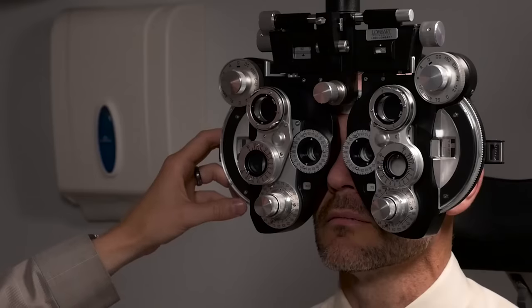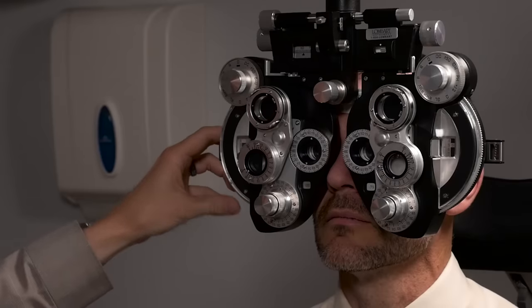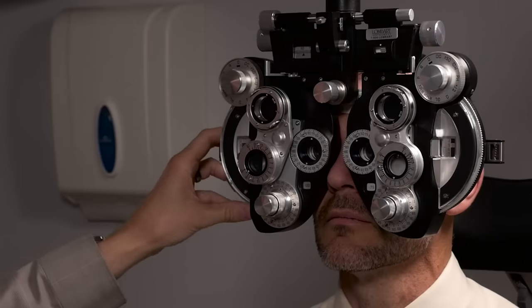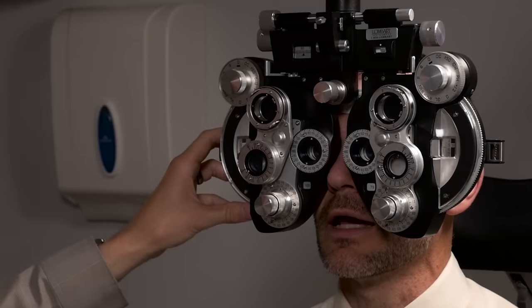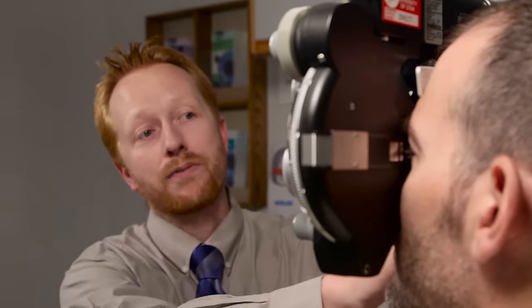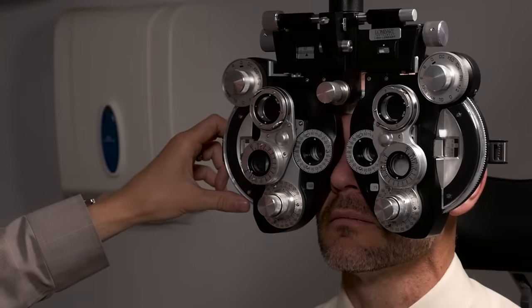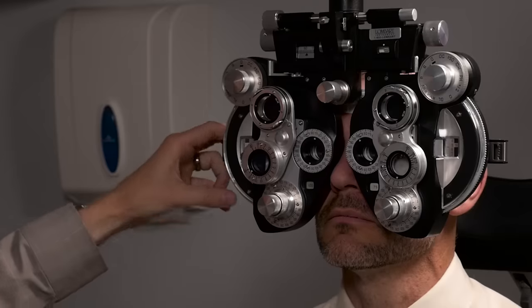So in this case I want you to tell me as soon as you can start to read those letters even if they're blurry. I'm slowly adding more minus to his prescription. So right when they say about there you know that you need to add another 0.5 to 0.75 more minus and that's going to be in the ballpark of your prescription. So in this case I'm continuing to refine the sphere. The sphere is on this side of the phoropter and I'm refining it to get as close as we can before I start refining the cylinder component of his prescription.